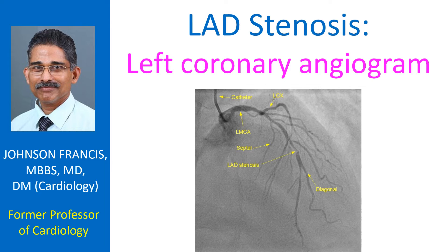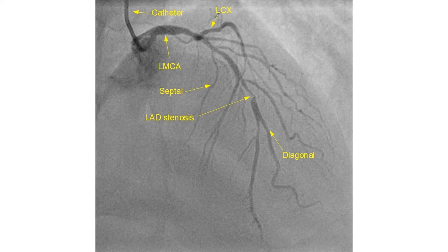A small diagonal and a septal arising at the proximal end of the stenotic LAD segment have ostial stenosis. A transradial catheter is seen at the upper end of the image. The left main coronary artery shows distal tapering prior to its division into LAD and left circumflex coronary arteries. The LCX also shows stenosis in its distal part, though this is a foreshortened view for LCX.